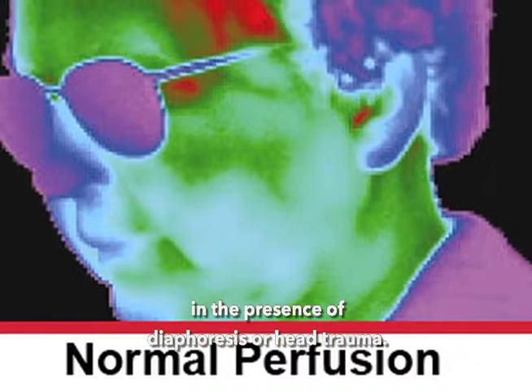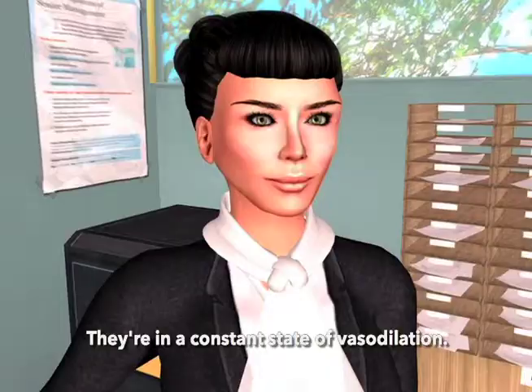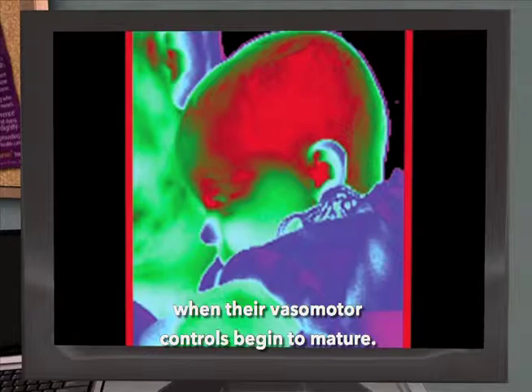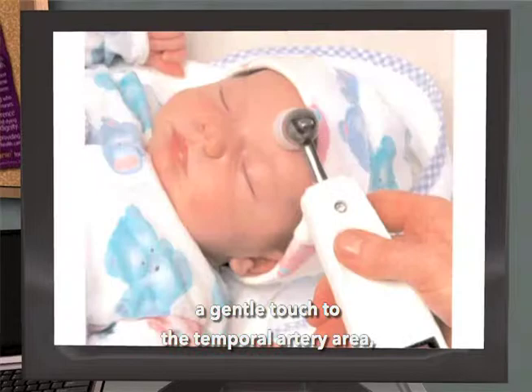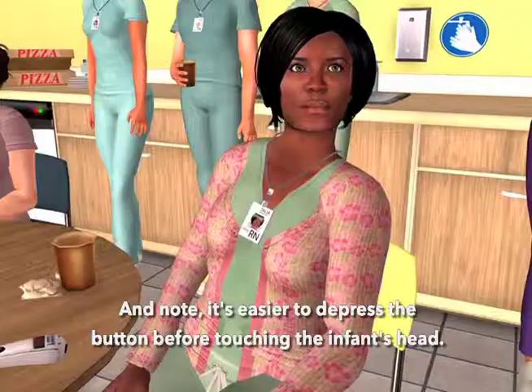Infants are in a constant state of vasodilation — yes, that's true until they're a few months old when their vasomotor controls begin to mature. As vasodilation is the prerequisite for making the measurement, a gentle touch to the temporal artery area or just a two-inch scan across the temporal artery area is all that's required. Note that it's easier to depress the button before touching the infant's head — they can be a little fractious.